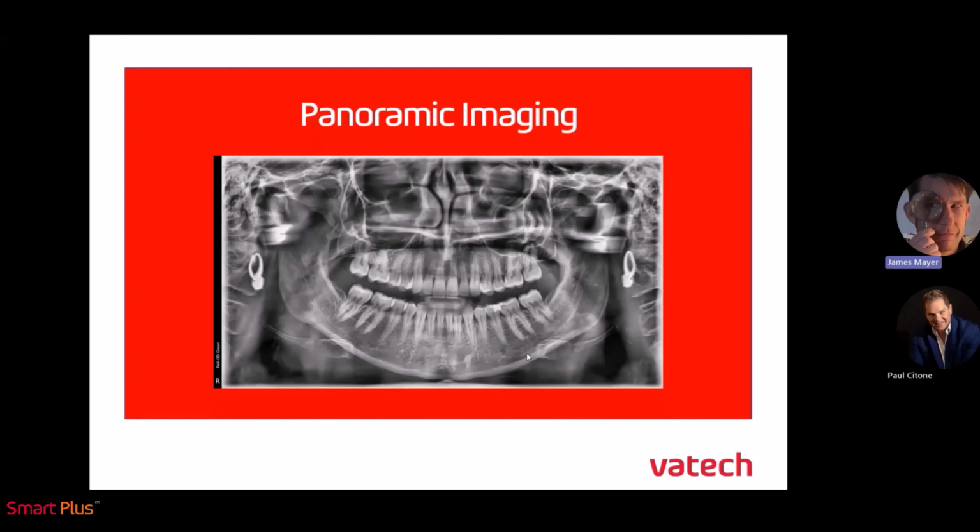I would say this patient's been positioned properly, but Paul, what are you seeing in the image? Well, I would say the head's tilted slightly, but we see the earrings in the image. And then again, also the streaking above that look like little rectangles are from the earrings. Yeah, so I think that's the thing of, we get our earrings in here and the sinuses, we get that streaking effect and the distortion above those earrings. Otherwise, beautiful pan. Let's look at one more before we conclude.